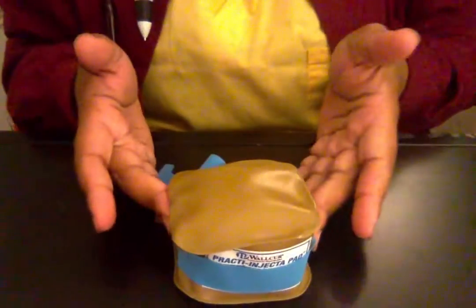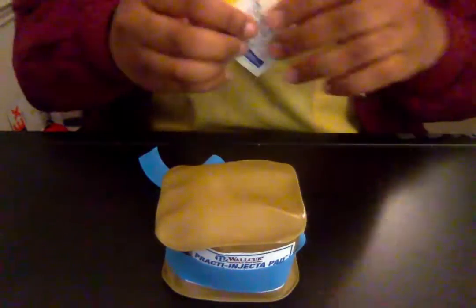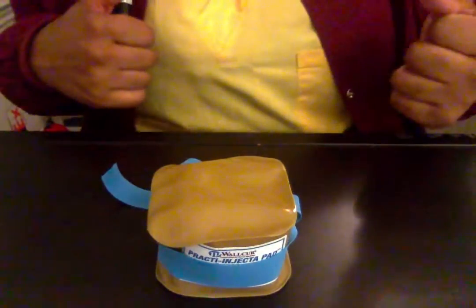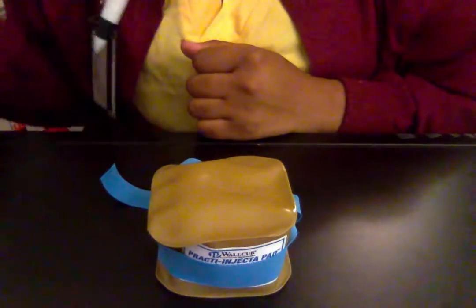So now that we have the tourniquet on the arm and it's in the dependent position, I'm going to be able to see a little bit. And even if I can't find a vein, I can just take an alcohol swab, just wipe it, and it'll kind of bring up some of it. So now that I've done that, I'm able to find that vein that I want to use. I see it coming up.